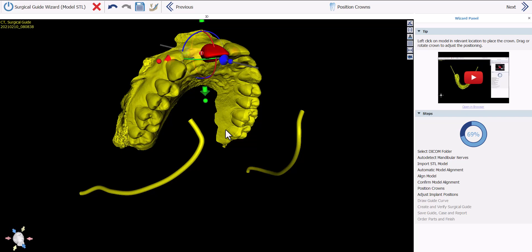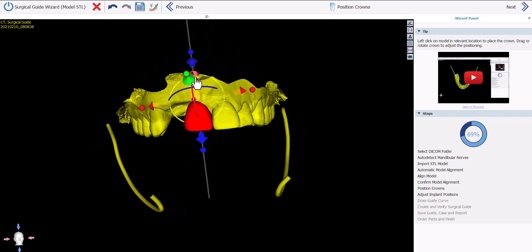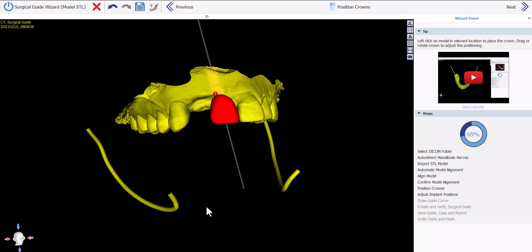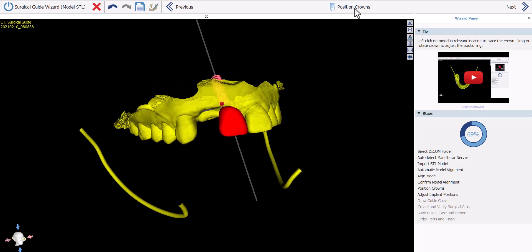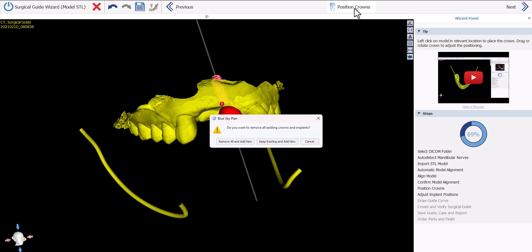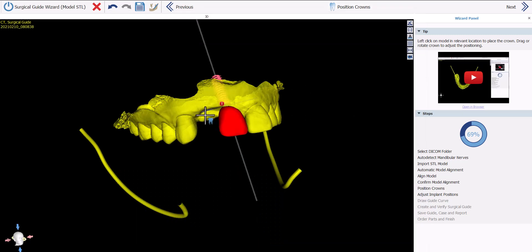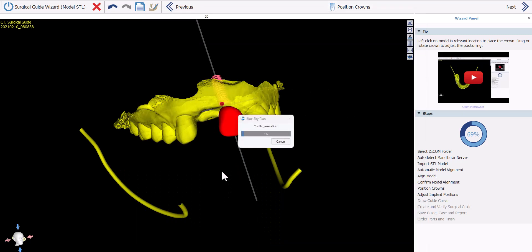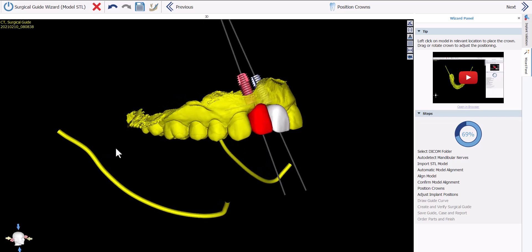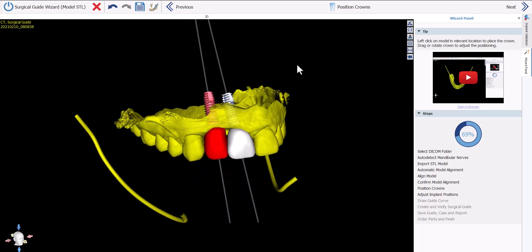The software has generated a tooth and placed the implant. Now we repeat the process for the additional missing tooth. Click Position Crowns again — the software asks if we want to remove the existing one or keep existing and add new, which we select. Choose the additional tooth, confirm the implant size, click OK, and left click once in the area of the missing tooth. Now we have both teeth generated and both implants positioned.